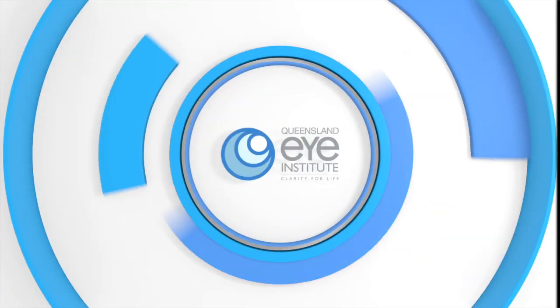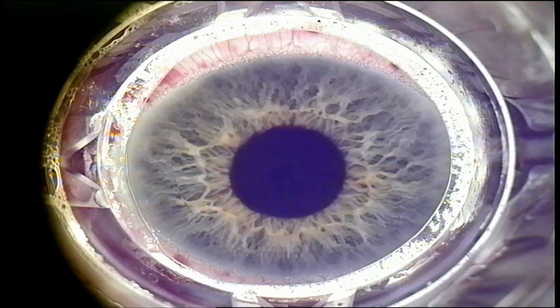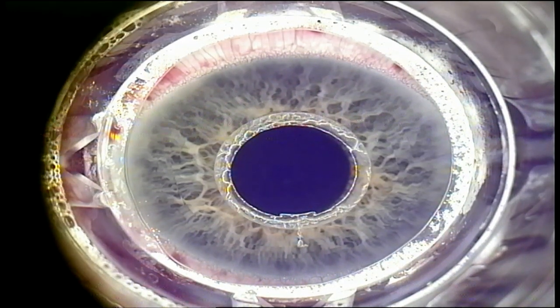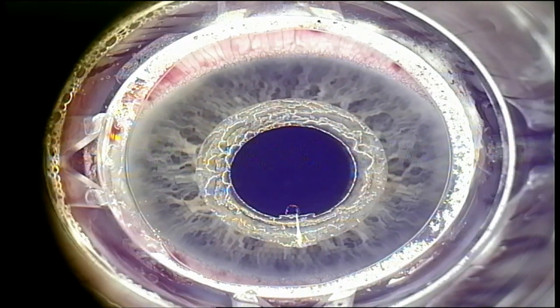Let's look at some real images of the surgery so you can really understand it. Remember, this procedure is performed in a hospital, so you're asleep for most of the procedure. The first part — the tunnel that's created in your cornea — is performed using a special femtosecond laser. You can see that special tunnel being created here. That only takes a few seconds.